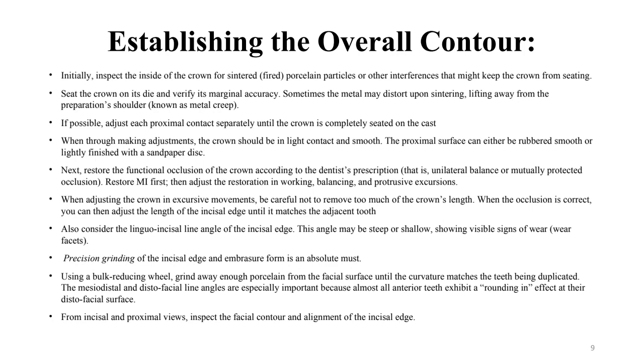If you leave that distal more square, and it might be just something minuscule, very, very minute, the eye is going to pick up that little mistake instead of seeing the whole picture, okay?